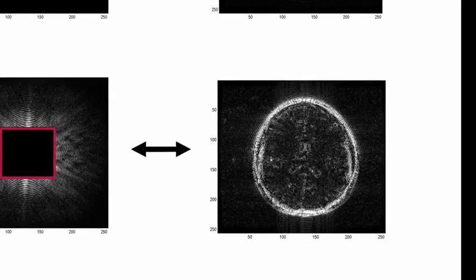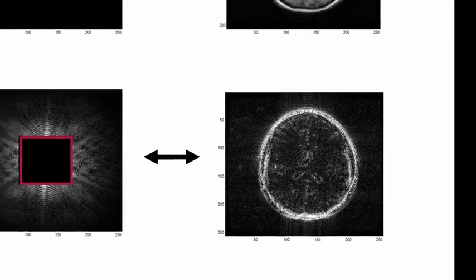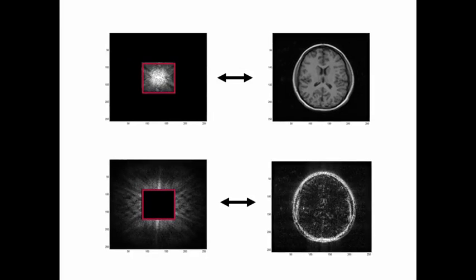Now these are only looking at K-space points that are far out, so they correspond to sinusoids that are highly oscillating. This is the type of information that we need in order to make out fine detail. As you can see, we can see the skull very well, and the boundaries between gray and white matter, and boundaries in general come up very well. Because the Fourier transform is a linear operation, these two images on the right-hand side add up to the other image. So this is really a decomposition of the image into two parts.